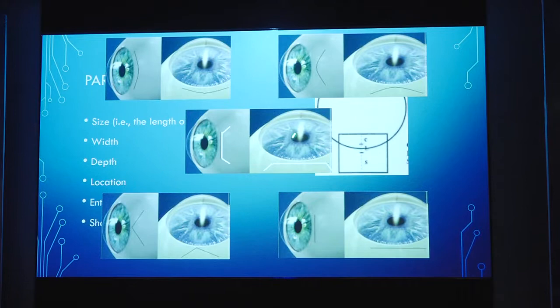If you see, these are the different types of incisions. This incision, where it is parallel to the limbus, will cause a lot of astigmatism, and that is not to be done. This is very easy to make. This is what we teach our residents: make a straight line 1.5 millimeters behind the limbus and then make back cuts. While teaching them, we tell them to make a boat, like we used to make in school, an upside-down boat. This is a modified frown, which is correct.